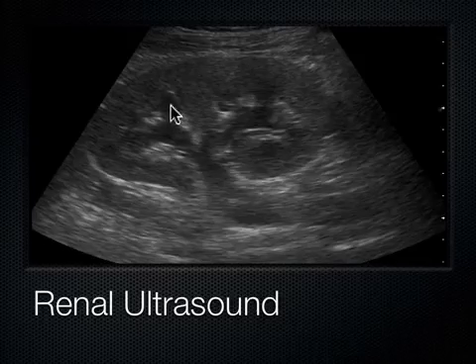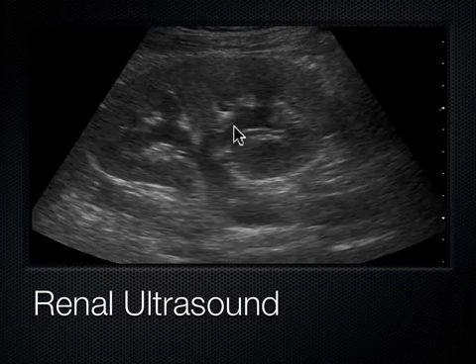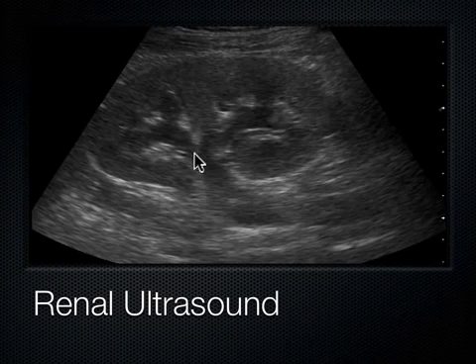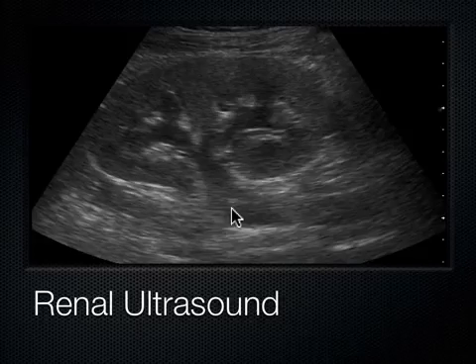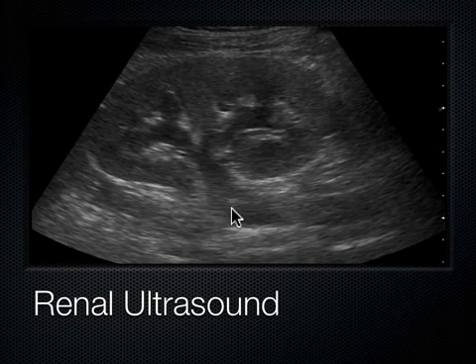And so then these pyramids, they all coalesce and drain into the renal pelvis, or sometimes you call this the sinus of the kidney. And here, this is why it's anechoic, because there's more fluid coming there, and then eventually they exit out the kidney and into the ureters. And the ureter comes down, one from each kidney, they come down and they enter into the bladder, in the back of the bladder. And you don't see the ureters very well in ultrasound because the ureters are covered by bowel and fat and things like that. So they're really hard to see. They're very small usually. Unless they're dilated, then you can see them. So once the ureter exits the kidney, we no longer see it.